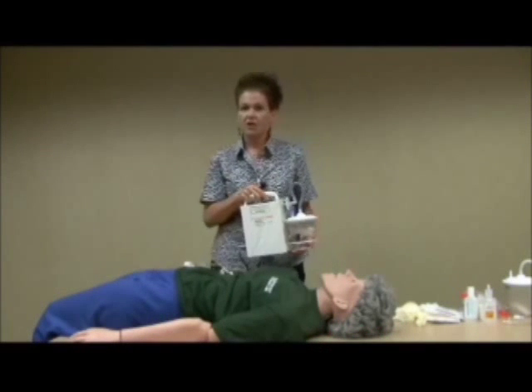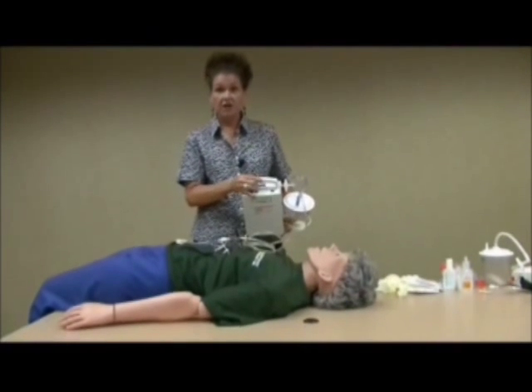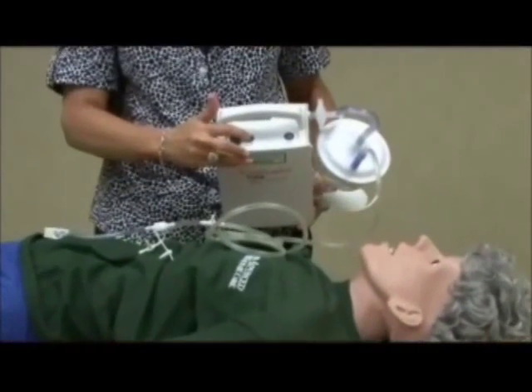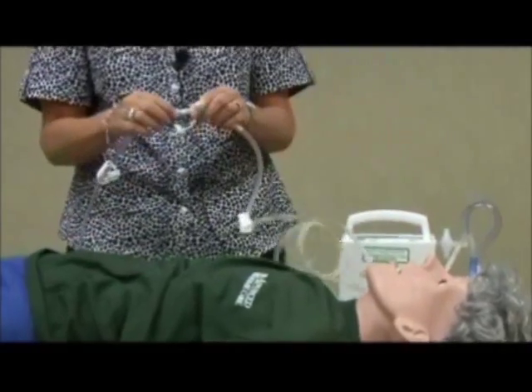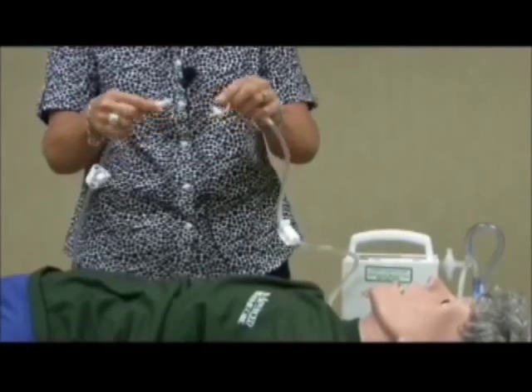To change the canister on your Vista negative pressure wound therapy machine, you'll need to turn the machine off first by pushing the button in the middle with the straight line through it. Then you'll disconnect the tubing from your dressing by pressing the orange clips on each side and pulling the tubing apart.